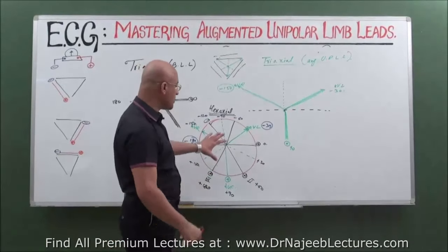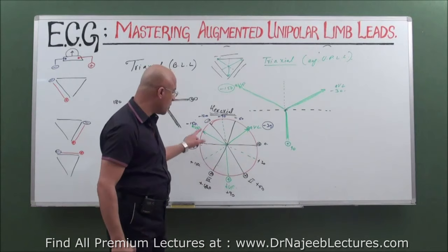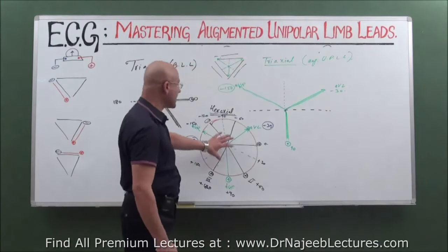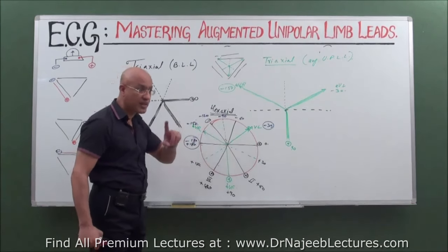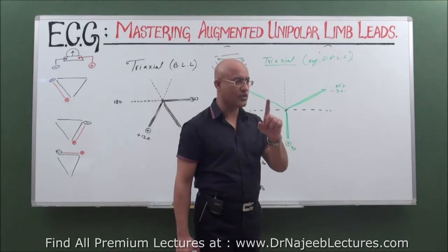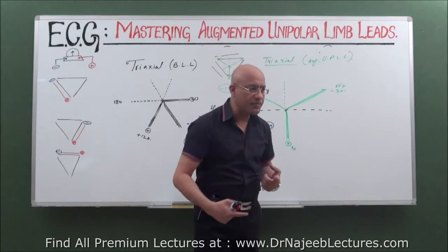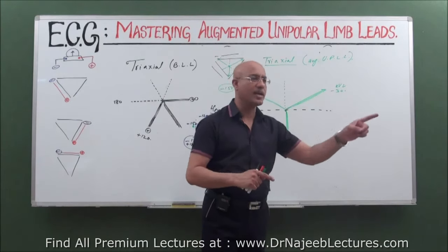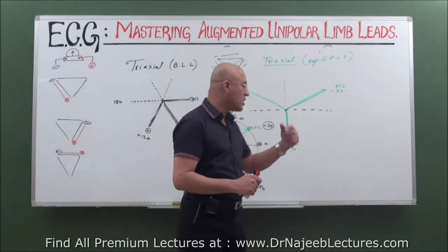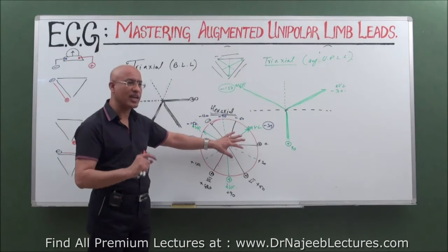This diagram helps you not only to know the orientation of frontal leads relative to each other, but also to designate where the positive poles are. But what is the use of this diagram? The use of this hexaxial limb lead frontal plane system is to determine the electrical axis of the heart. Is the heart having a normal electrical axis, or is there a right axis deviation or left axis deviation? That we will discuss in a future lecture. But after this lecture, we are going to talk about chest leads, right? And later on, when we come to the clinical ECG, we'll talk about how this hexaxial frontal limb lead system is used to determine the electrical axis of the heart.